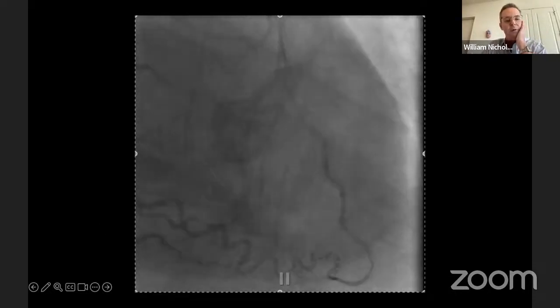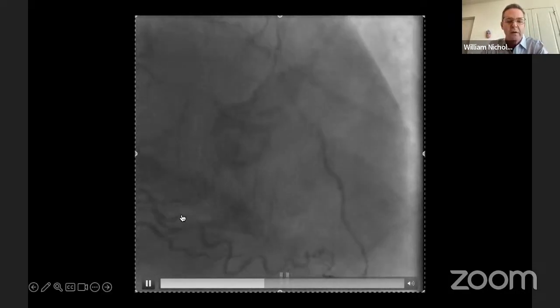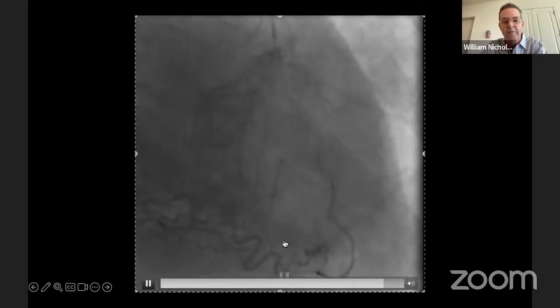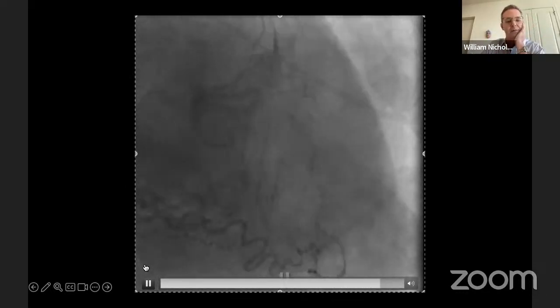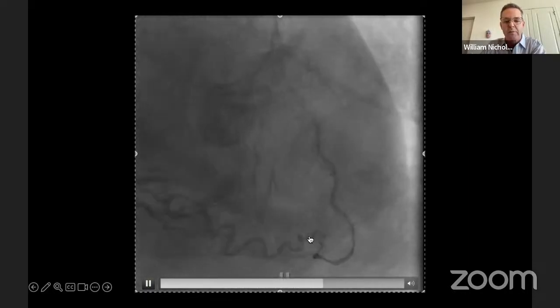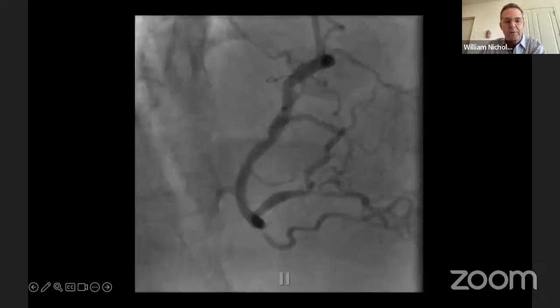So this is a right coronary dominant vessel, obviously, but not a huge PDA. And if you look, it really sort of has mild septal collaterals connecting to the LAD, which is obviously occluded. And then there's a big RV marginal that comes around and hits the apical LAD. And it's important there too that this RV, there's another small branch, and I'll pause this for a second, but there's another small branch coming off that's actually going to give rise to some connections to the LAD as well. And so both possibility of septal connections, but these epicardial connections up towards the tip would not be usable safely, I think, in pretty much anybody's hands.